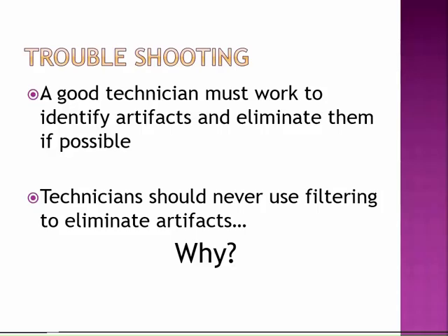If you don't apply the electrodes well, if you don't have them in the place where they should be, there's instances where they sometimes have had to repeat sleep studies because, well, this isn't a good test, this isn't a good study. And it's your job to get a good study. So that's why it's so important to apply the electrodes accurately and well, so that they're going to stay on the patient throughout the night and you're going to get a good signal from them.